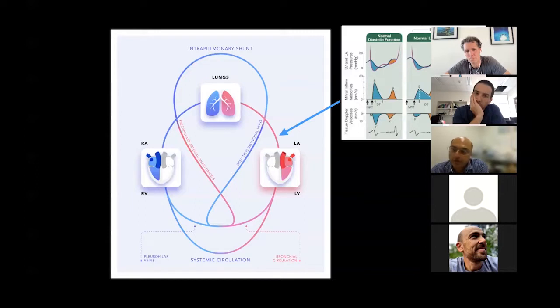So if we talk about E to A ratio, first, it's a load dependent measurement. The E wave can go up in cases of valvular regurgitation, and the left atrial compliance and the left ventricular compliance get altered and may not give an accurate measure. Filling pressures, the volume status, all of those sort of measures will affect it, and the angle and the adequacy of your image will also affect the E to A ratios.